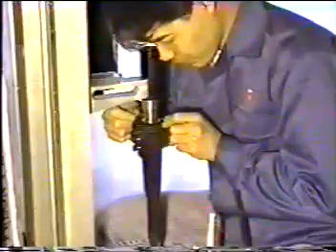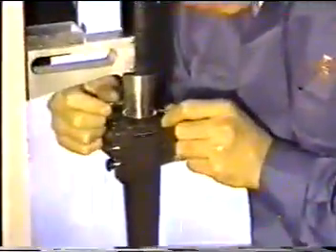The center of IG mask should be aligned to the scale of the jig JA3009. Four screws are provided to adjust the mask location. Pay attention not to make the mask tilt severely. Adjustment of EYP focus.